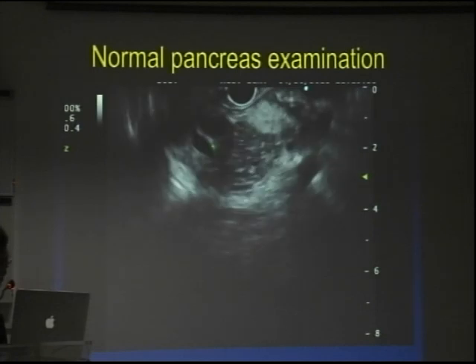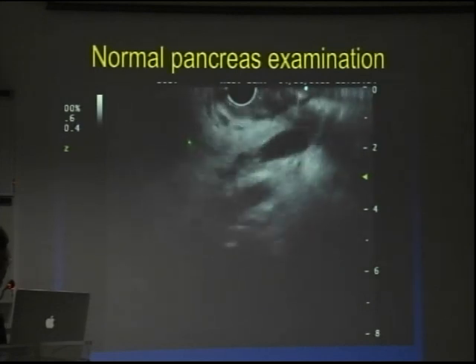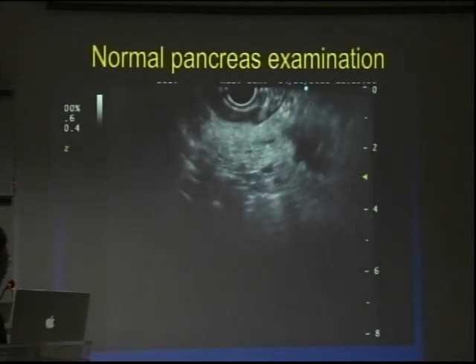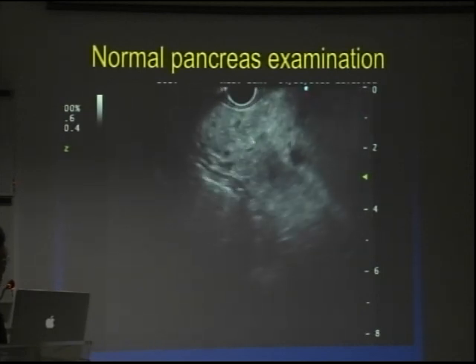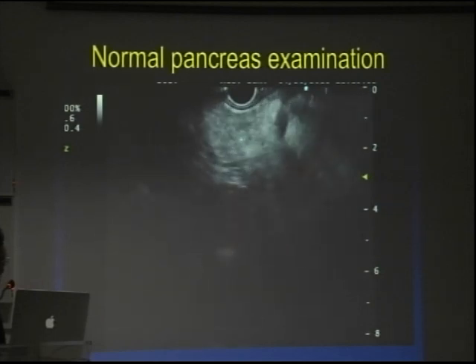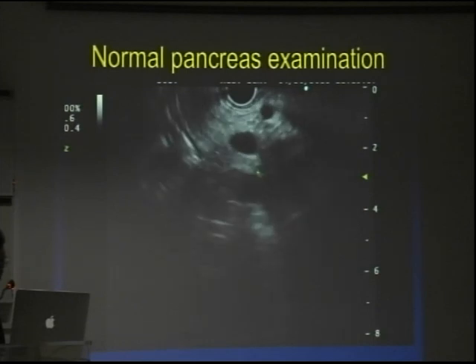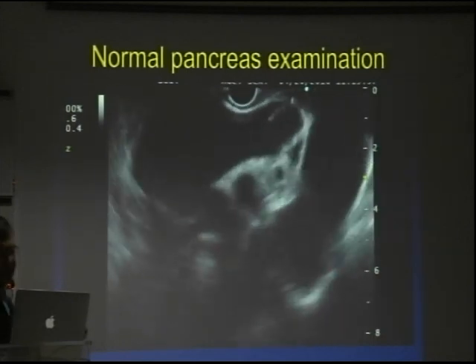So you unlock all the wheels. You see the pancreatic duct coming up here. Now I'm about to fall back into the stomach, which I just did. We still did not lose the pancreas. We still have all the pancreas until we get back to the kidney and the spleen.